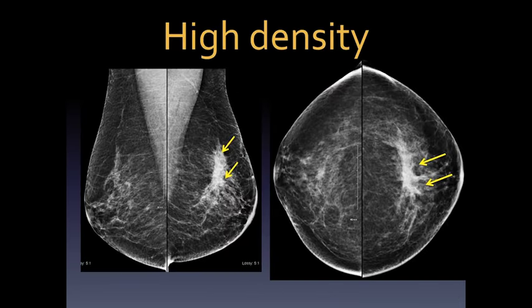Here are two patients with architectural distortion. You can see that this area has retraction of the adjacent parenchyma — the other patient also shows retraction toward that white center. Both had invasive ductal carcinomas. It's helpful to think of architectural distortion in the analogy of central flight hubs at a big airport like Detroit or Chicago, where all flight lines converge on a central point asymmetrically — not symmetric, all converging on one central hub.